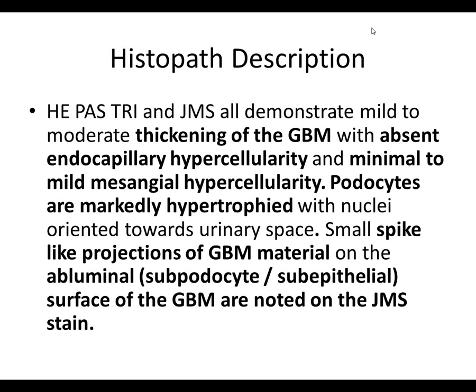I often talk about looking at histology, looking at the podocyte hypertrophy. And with studying with the MDs, they often look at how those nuclei are oriented. If they're really oriented towards the urinary space, it looks like the podocytes are jumping ship, is how they used to joke about it. Because the podocytes are really uncomfortable with the fact that there are electron-dense deposits beneath them. And I know that's anthropomorphizing, but it kind of helps everybody remember what's going on.